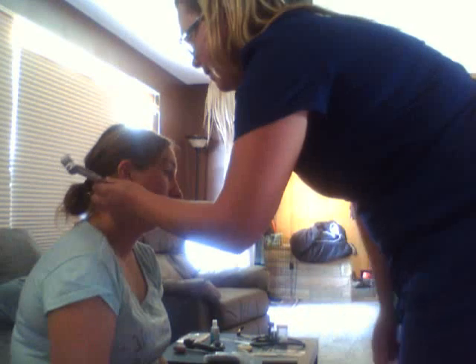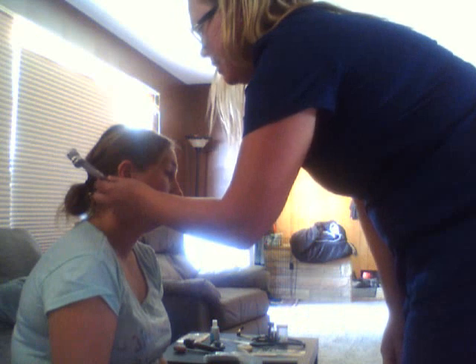Now I am going to do the Rinne test, and what I'm going to do is put it on the back of here. You're going to tell me when you can no longer hear the vibration, and then I'm going to move it up here, and you're going to tell me when you can no longer hear the vibration. I am going to set a watch right here. Oh, that's not going to work. And I'm putting this on the mastoid process.